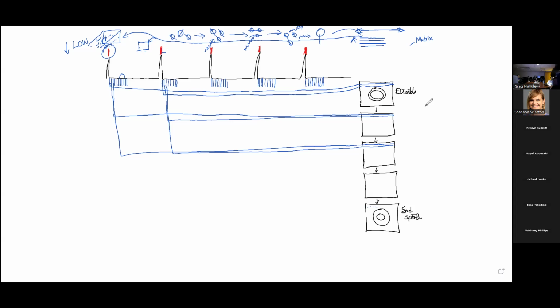So one of the key pieces of information to consider while we're doing this process is the temporal resolution, right? So over here on the right side of the screen, we need to capture frames in enough temporal resolution that we can capture end systole, right? And that temporal resolution that's very key is around 50 milliseconds, right? 40 to 50 milliseconds.